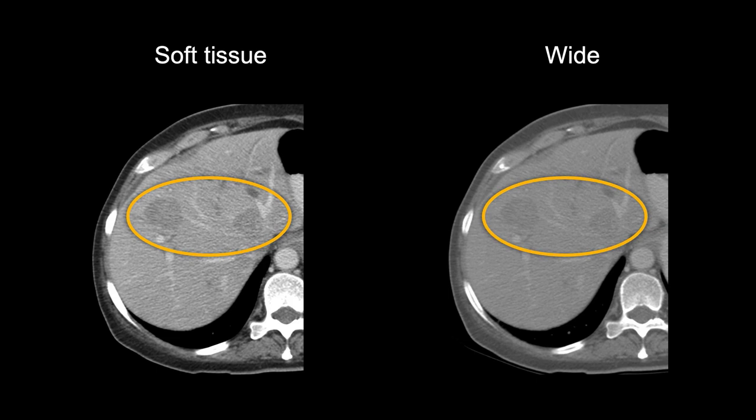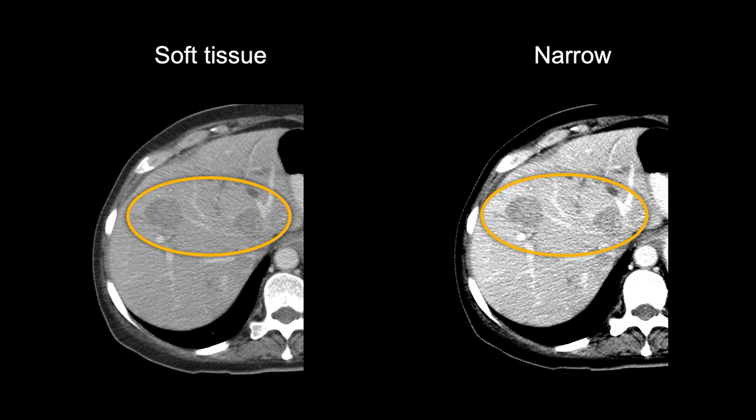But if we narrow the window, the changes in grayscale values occur more abruptly, which emphasizes subtle differences, making it easier to find subtle abnormalities in the soft tissue. In fact, a narrower window is so commonly used for viewing the liver that it is referred to as the liver window.